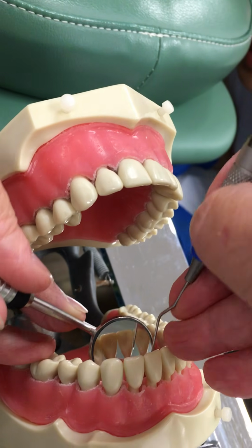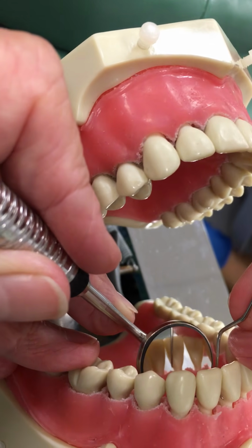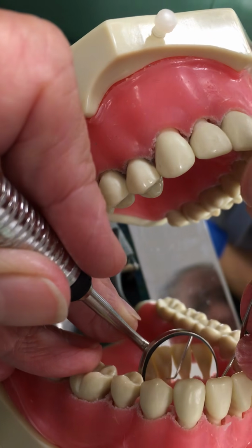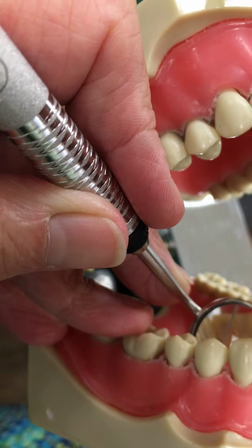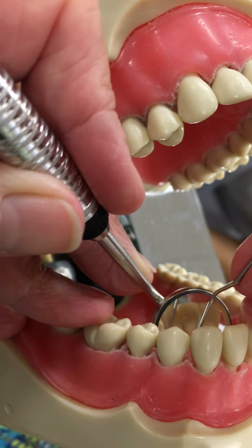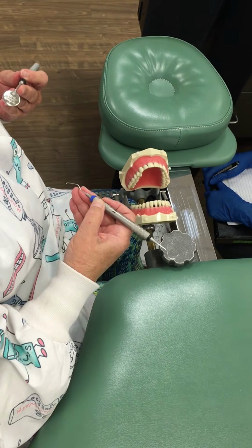Toe on, heel off. And I'm using complete indirect vision. I'm also using my mirror to retract the tongue and for illumination. I'm also using it for transillumination. And what does that mean? Through the teeth. Right. And that's going to show me any shadows that might be on the tooth or in the tooth. Right. So that was area 2, toward.